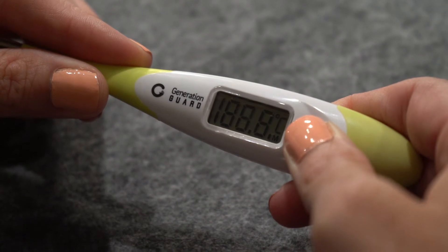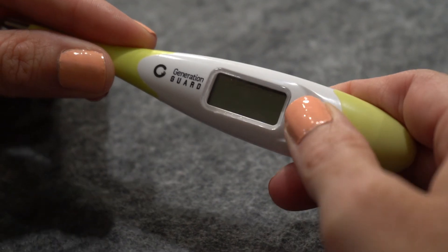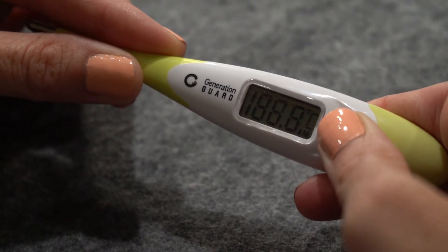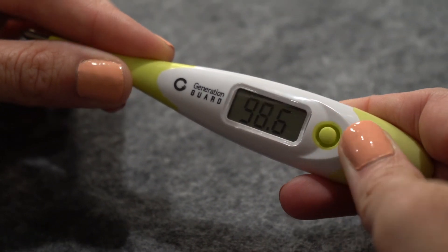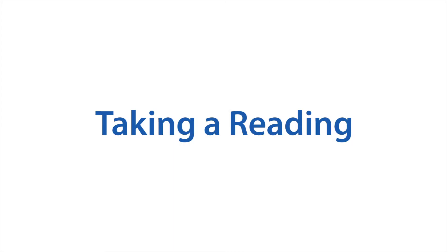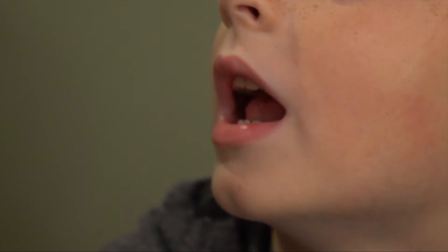The low battery symbol looks like an inverted T symbol. To switch from Celsius to Fahrenheit, first ensure the thermometer is switched off. While switched off, press and hold the on/off button until it shows a small F or C symbol at the top right of the display. This usually takes two to four seconds.